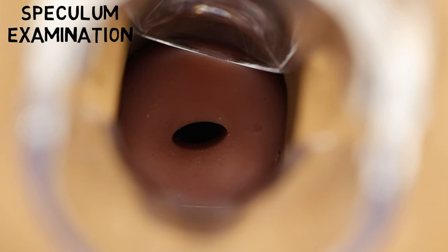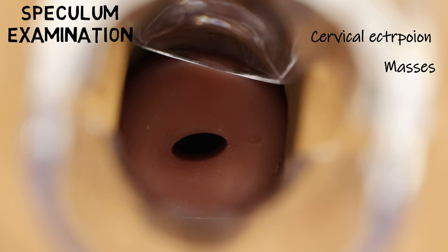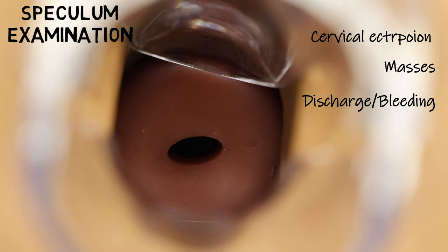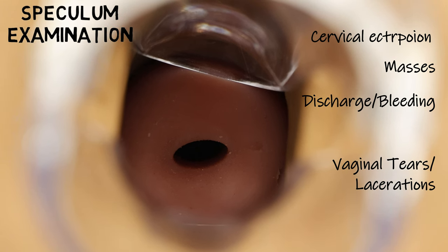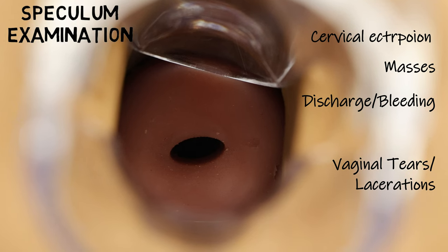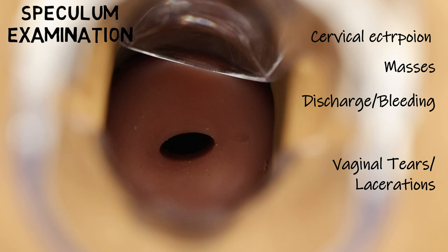Looking at the cervix, we want to identify any cervical ectropion, any obvious masses, any discharge or bleeding. Then we want to look at the vaginal walls and inspect for any vaginal tears or lacerations. One advantage of using these transparent speculums is that you can still inspect all vaginal walls during the examination.